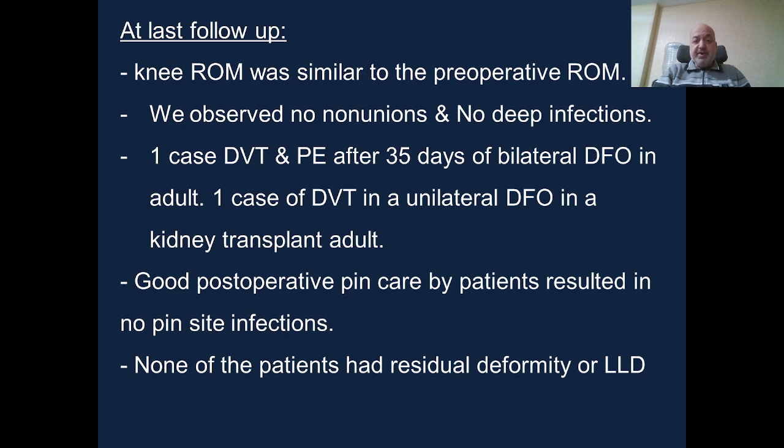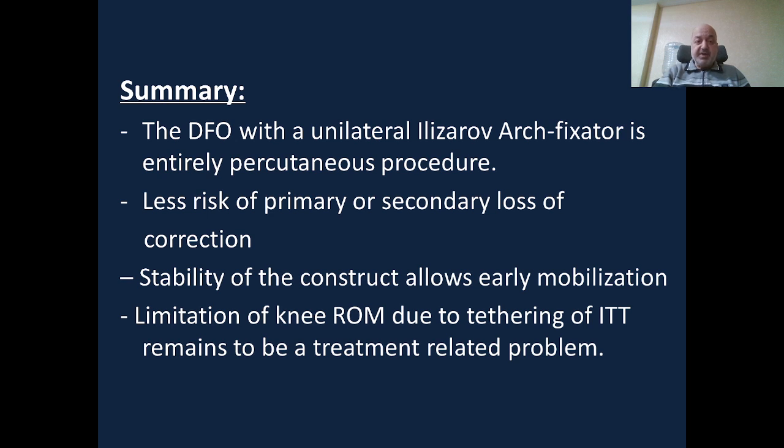The post-operative pin site care was maintained by the patient after our instructions on how to take care of the pins. None of the patients had residual deformity or leg length discrepancy.